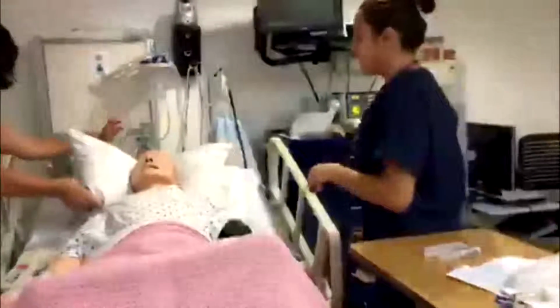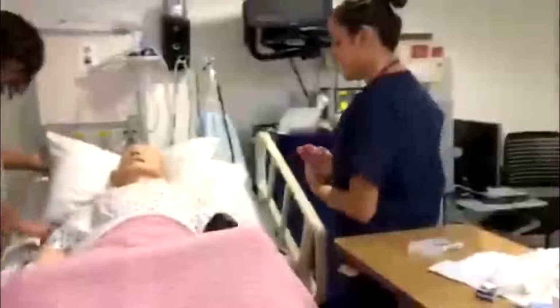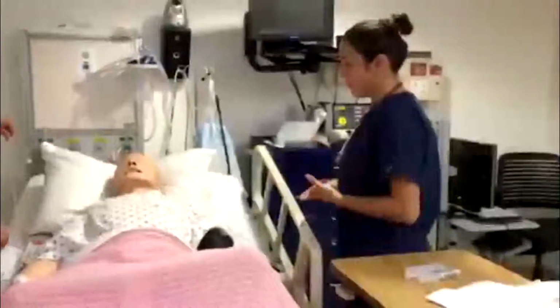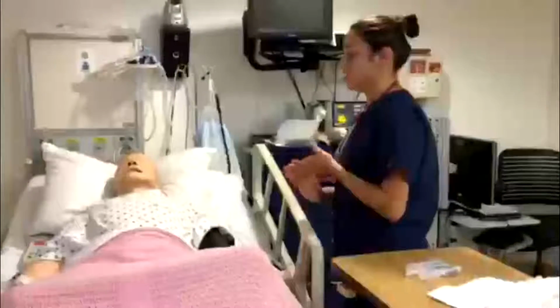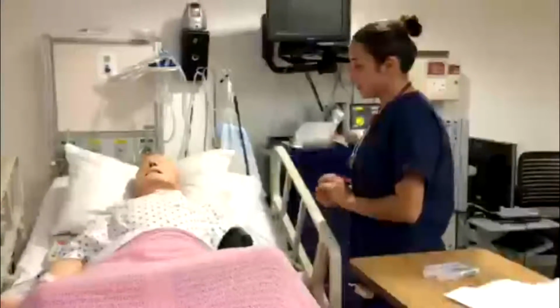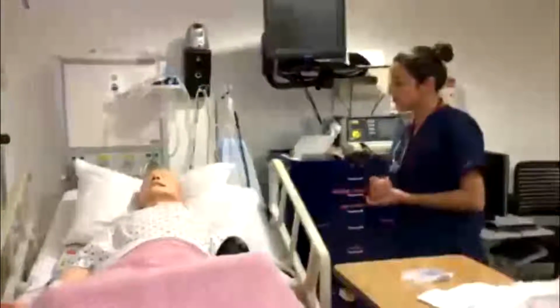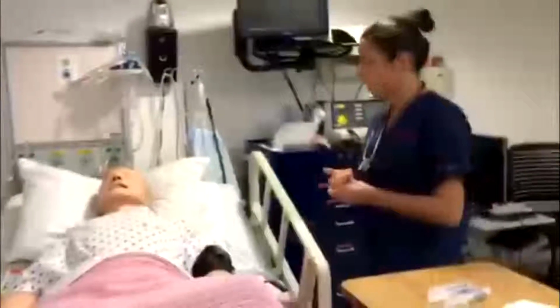Great. My name is Christy Martinez. I'll be your student nurse for today. Your physician ordered a couple of IV fluids for you. So the first is normal saline, 0.9% sodium chloride, and the second is Zosyn. Okay, have you ever had Zosyn before? No, I don't believe I have.